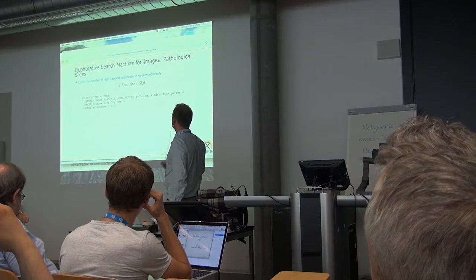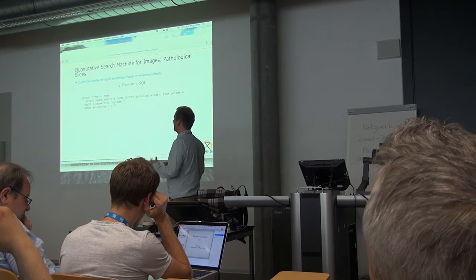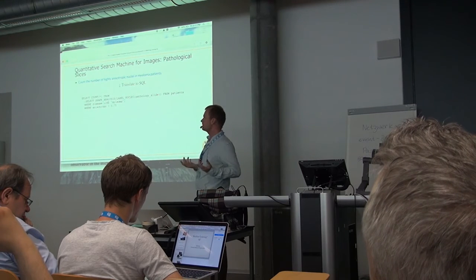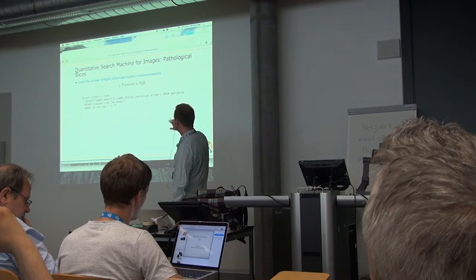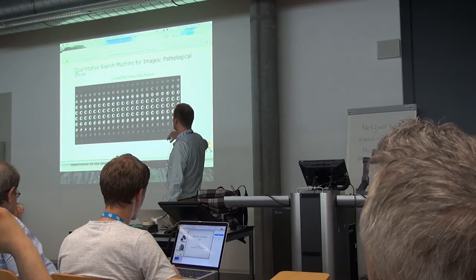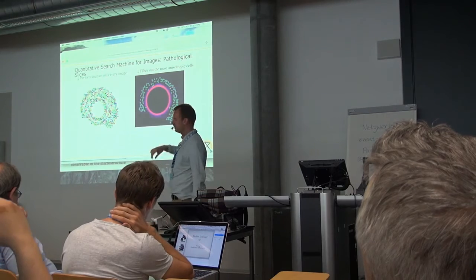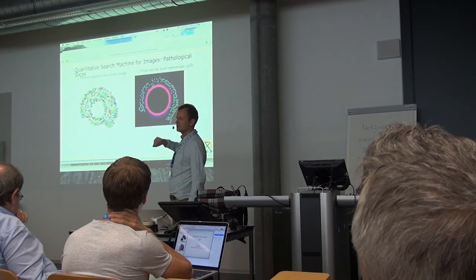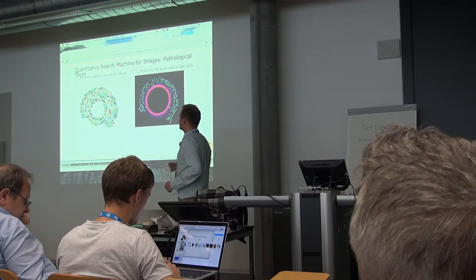Similarly, in a pathological example, where you're looking at pathology slices from hospitals, you could say, count the number of highly anisotropic nuclei in myeloma patients. This will then be translated into a SQL statement where you run the shape analysis, label the nuclei, do everything else, and export the results. And so what happens there is, of course, it loads in the background all the myeloma data from patients, performs the analysis on every image, and then filters out the anisotropic cells that you're interested in, so you have your final result. And it doesn't matter if there's a terabyte of data or 100 images, it scales and distributes it using whatever resources are available.